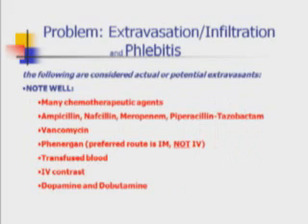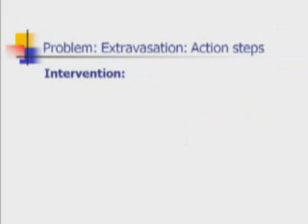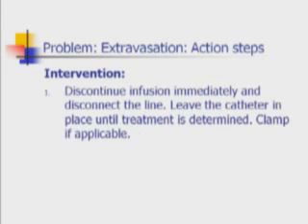Begin to understand extravasation by knowing what medications and infusions can cause it. Here are a few common ones. Pharmacy has the most common and complete list of extravasants and their antidotes. Whether or not you are sure that it is an infiltration or an extravasation, follow these steps.